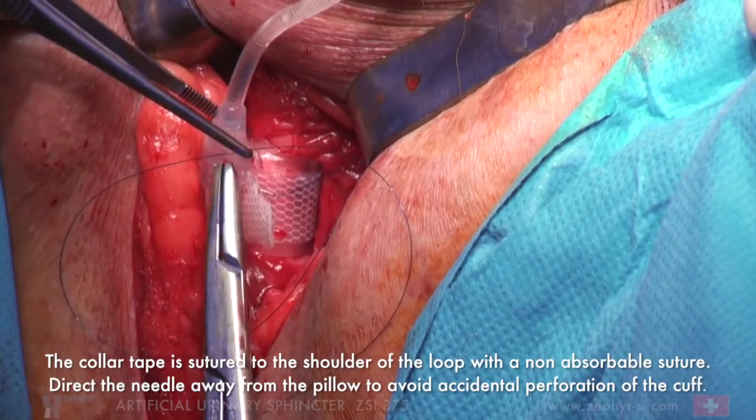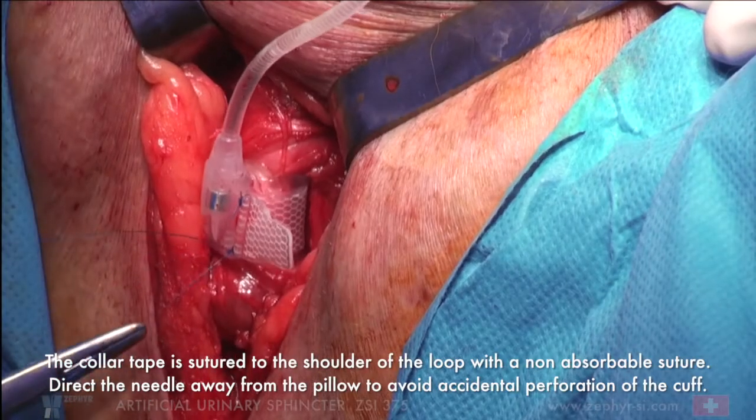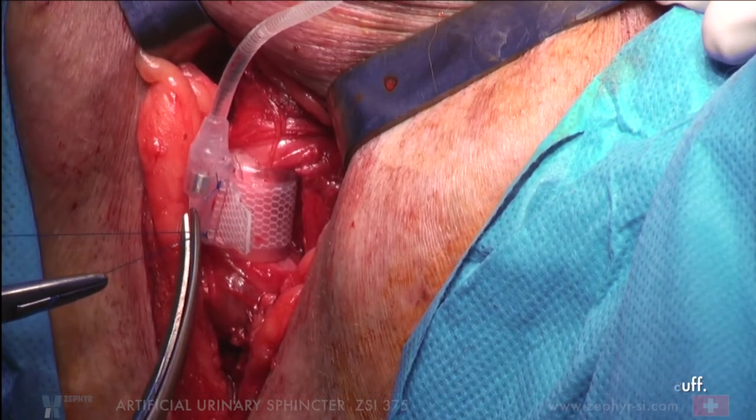The collar tape is sutured to the shoulder of the loop with a non-absorbable suture. Direct the needle away from the pillow to avoid accidental perforation of the cuff.